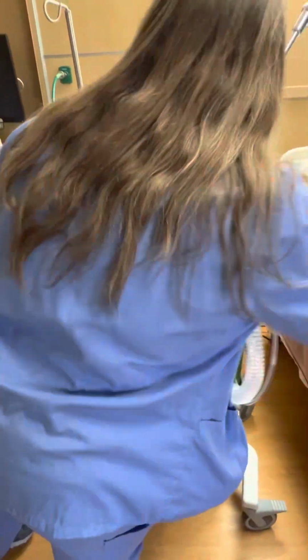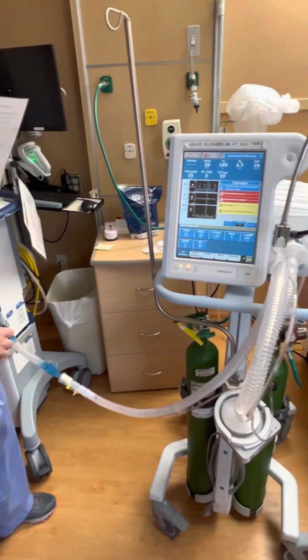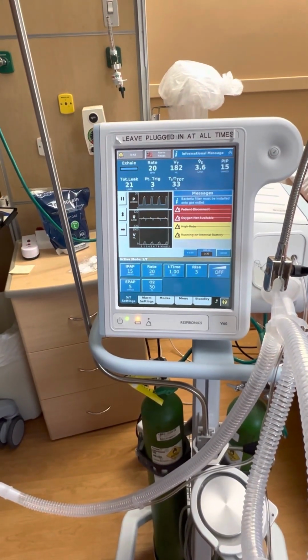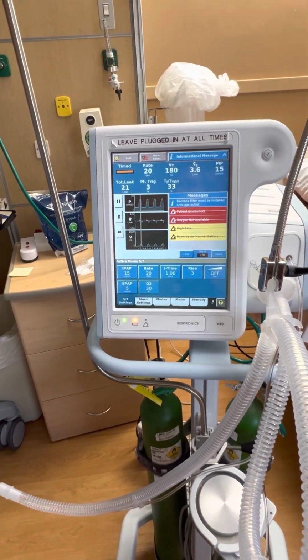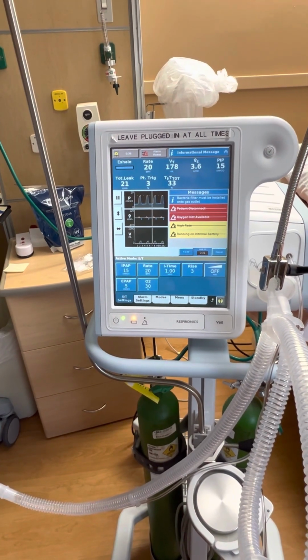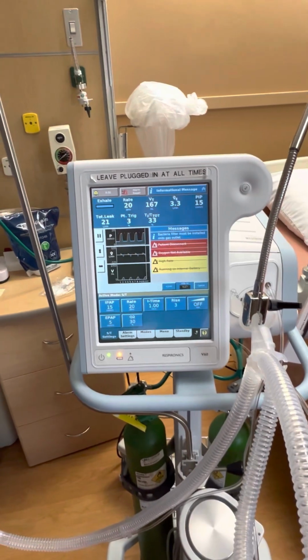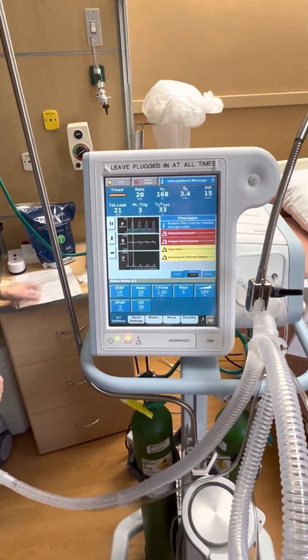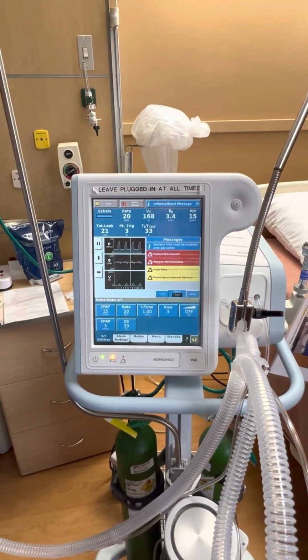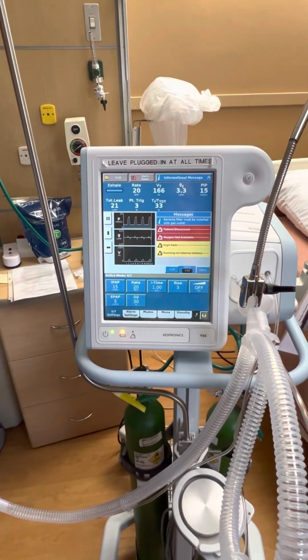Now when you chart this, you chart it as non-invasive ventilation, and when you start it on a patient, it's first day, and after that, it's subsequent. And nursing is in charge of charting or charging for that, because I am not here every day, and so it's easier just to leave it as one person. If you start again this in ER, bring that one up and grab the one from second floor and bring it back down. Saves on equipment and not having to dirty another circuit.